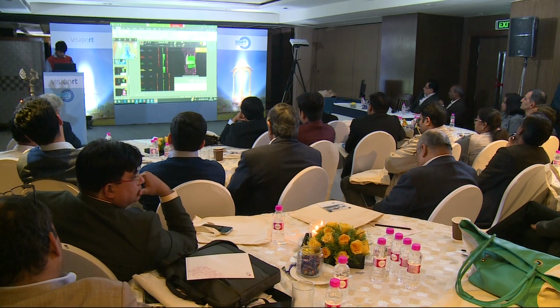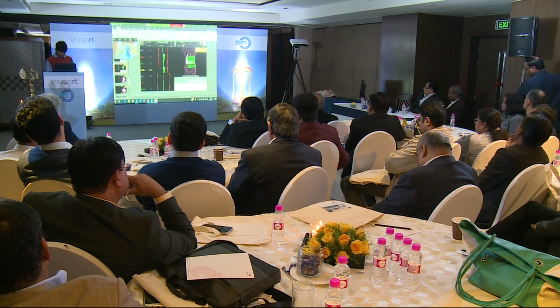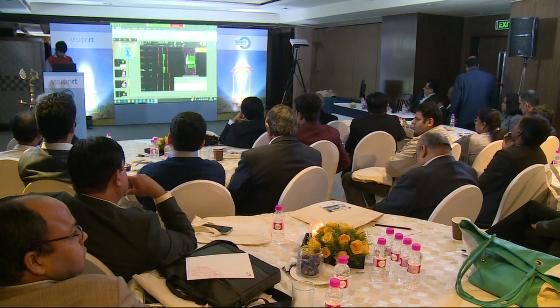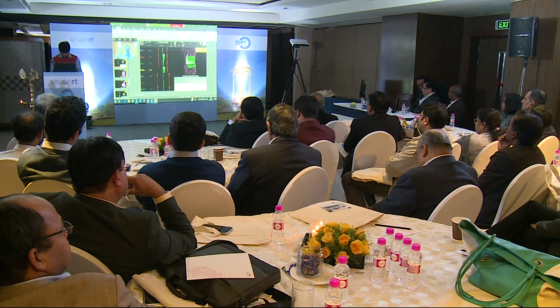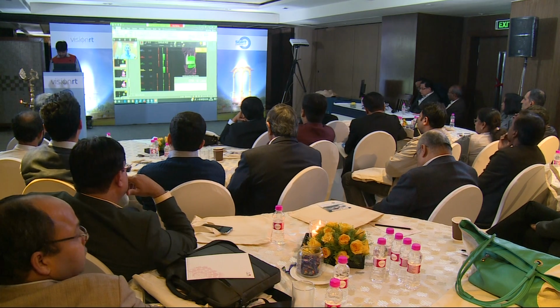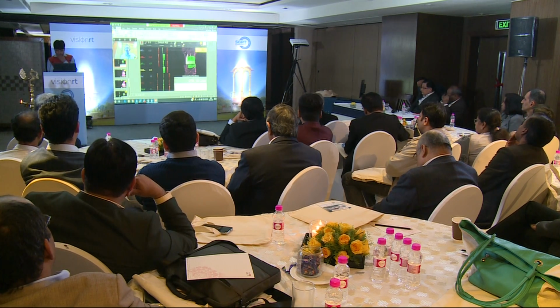And then once you have that done, you go in and you do your cone beam CT, you take a look at it, and now you can move the patient as a rigid body and you're not splitting the differences. You don't have to open up your PTV margins because there's going to be some pitch problems.